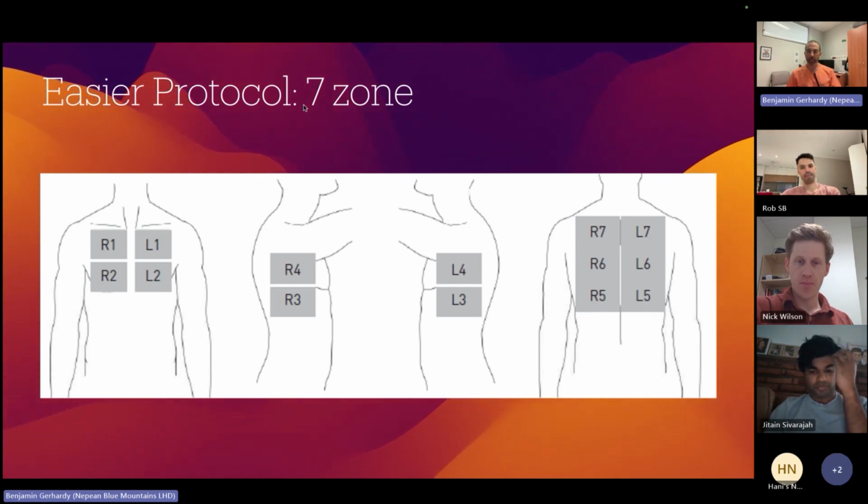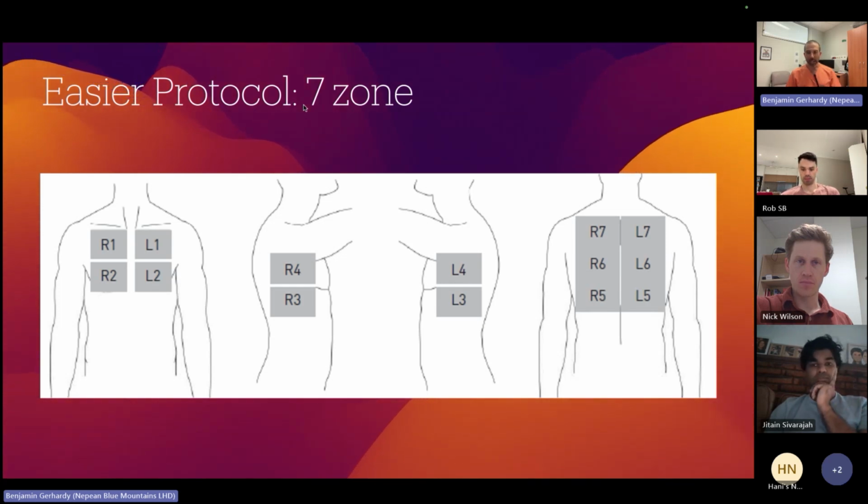Now, at the end of the day, if you've got a really unwell patient, the things that you're looking for won't be subtle, they'll be bloody obvious, right? However, it can be quite useful for loculated collections, things like that.